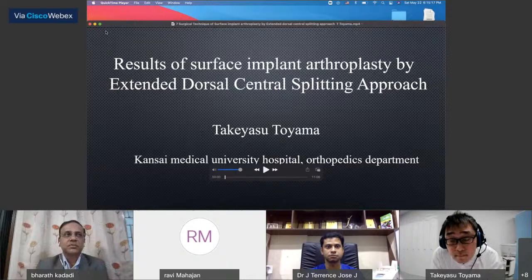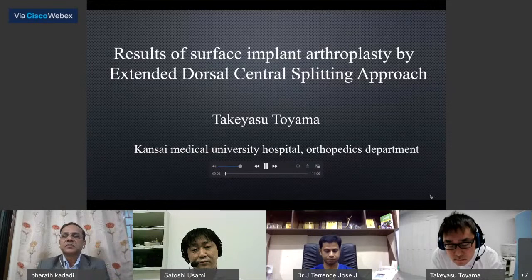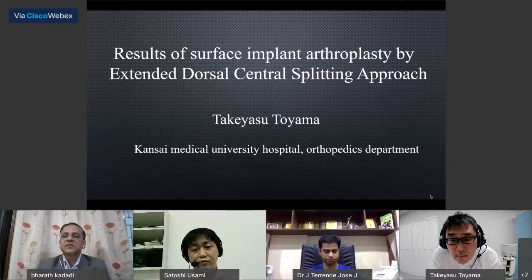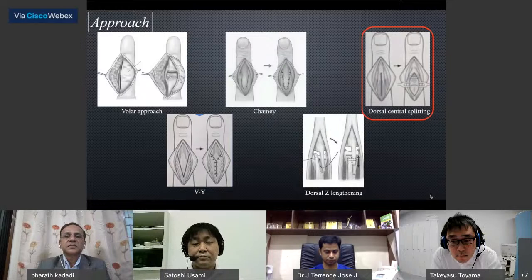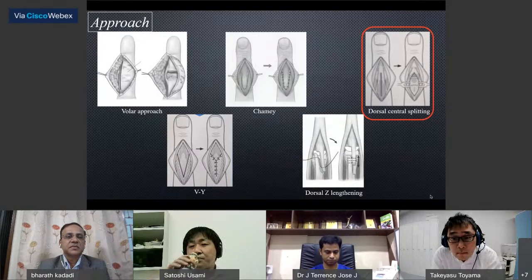My presentation is about results of surface implant arthroplasty by extended dorsal central splitting approach. There are various approaches for PIP implant arthroplasty. We are currently using the extended dorsal central splitting approach for most cases. Today, I will report our procedure and clinical outcomes.